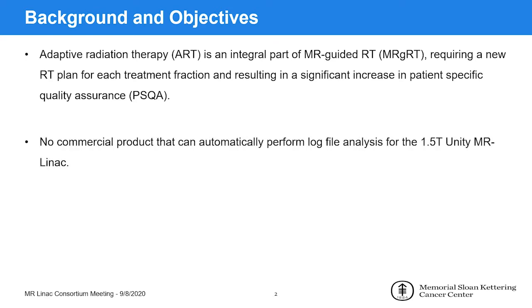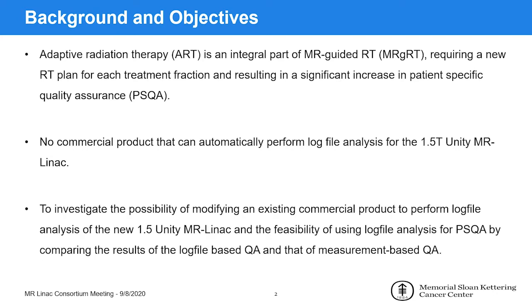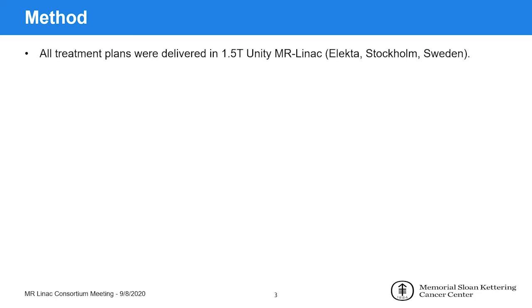Naturally, we would like to extend this QA process to our new MR Linac program. However, at the time of the commissioning, there was no commercial product available that could meet our needs. So we investigated the possibility of modifying an existing commercial product to perform the analysis for the Unity and the feasibility for patient-specific QA. All work, of course, was performed on the Unity.